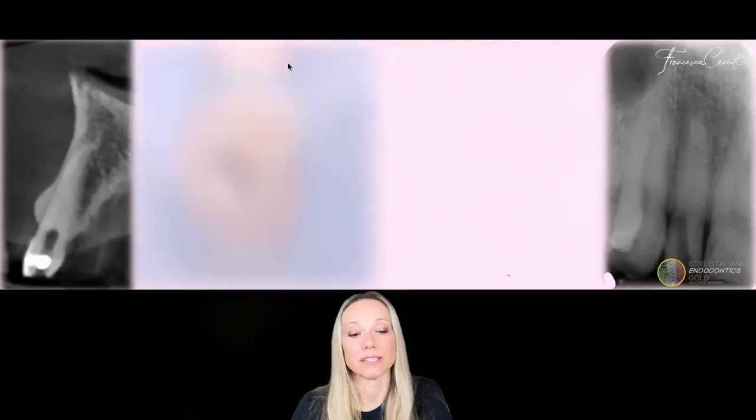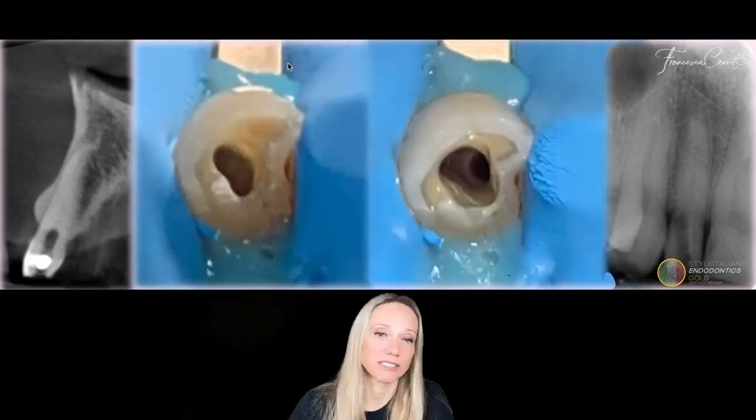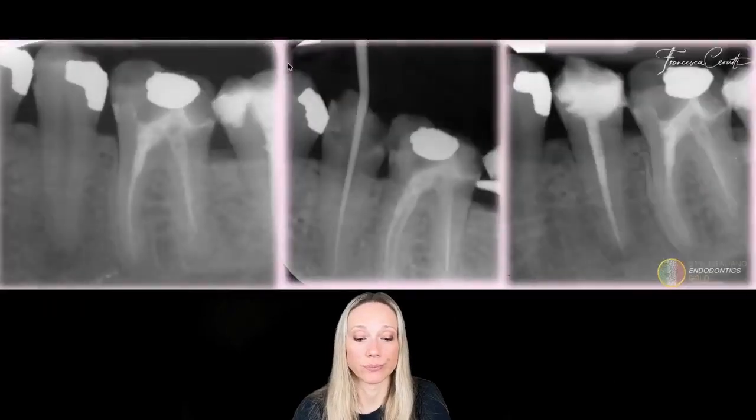And the same thing can be said for the other side of the mouth of this poor patient that had the same problem, so wrong access cavity that was corrected, and then the therapy was finished, and you see the follow-up at the long term.